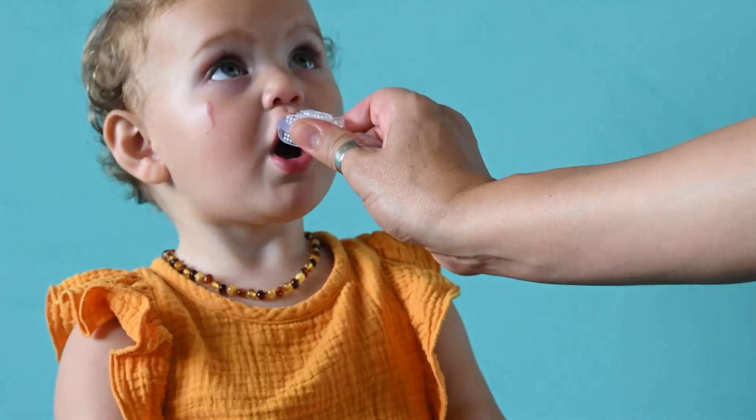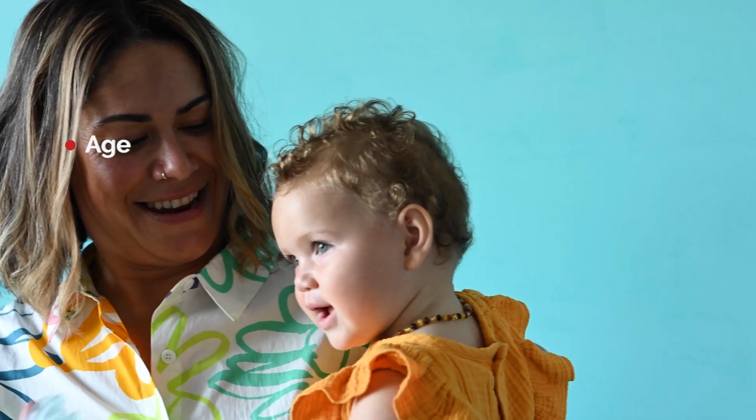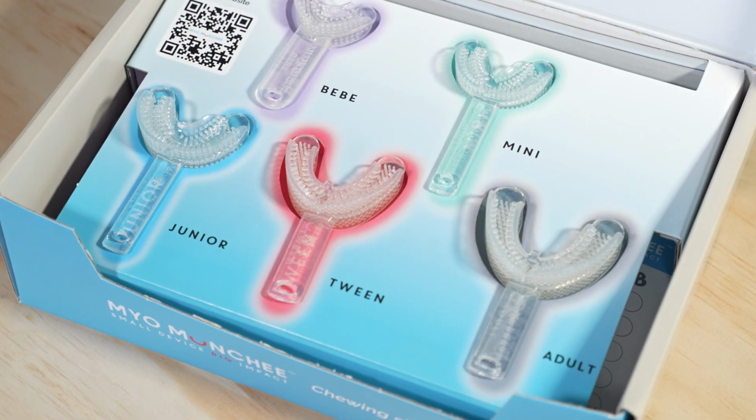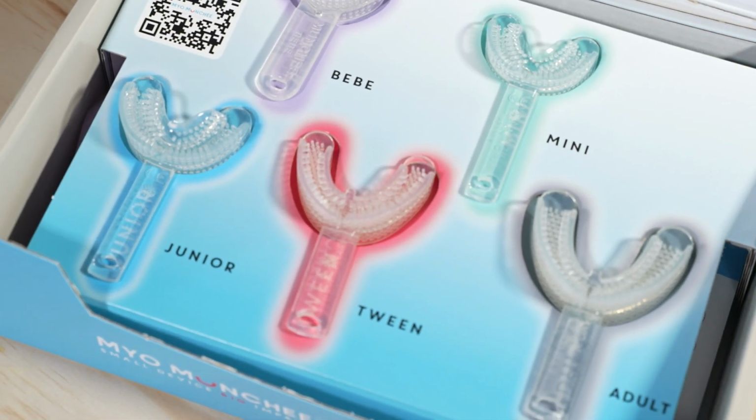The 3 most important factors for you will be age, intercanine width measurement, as well as overall build. Match them up with the sizing guide recommendations and you should be all good to go.